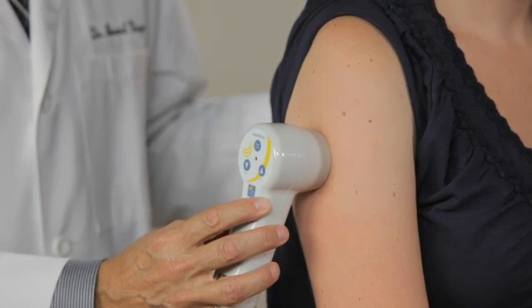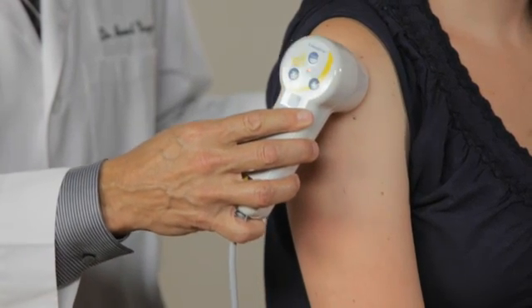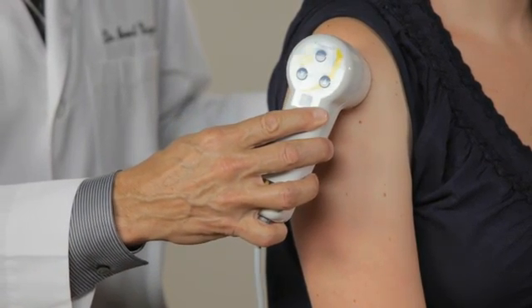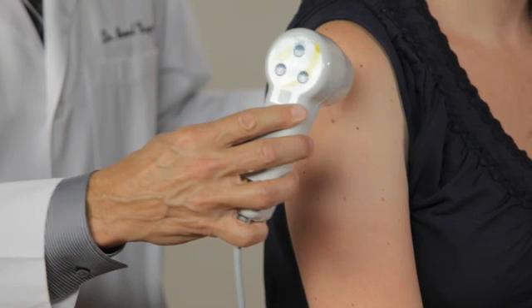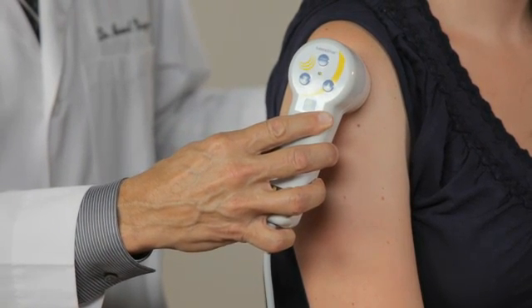Again, we heard it, you can see it's red. We lift and start to scan again. Picked up another point, the light is red. We lift, set back down and we are again treating that particular area.